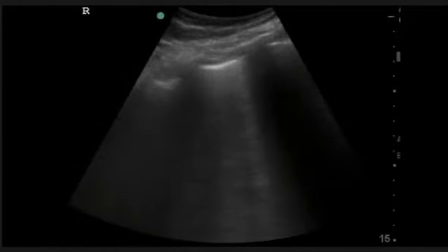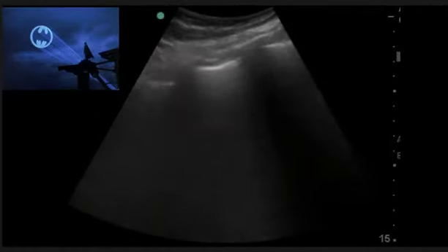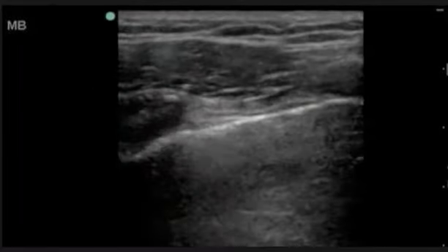These are B-lines. They shoot all the way down from the pleural line down to the bottom of the screen. Usually you need your depth to be about 15 centimeters to prove that these are really B-lines and going all the way down. They look like searchlights. You shouldn't really see a B-line in a pneumothorax, but you can see them in viral pneumonia, fluid overload, and lung contusion.